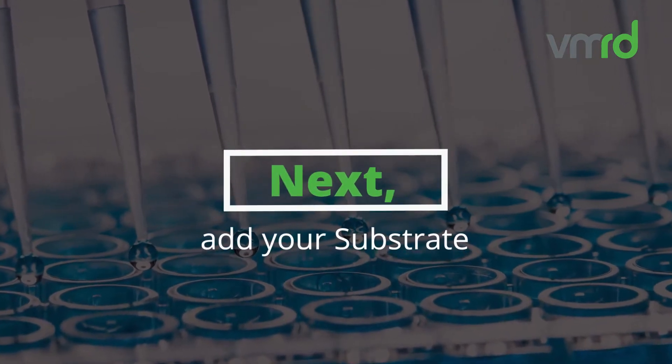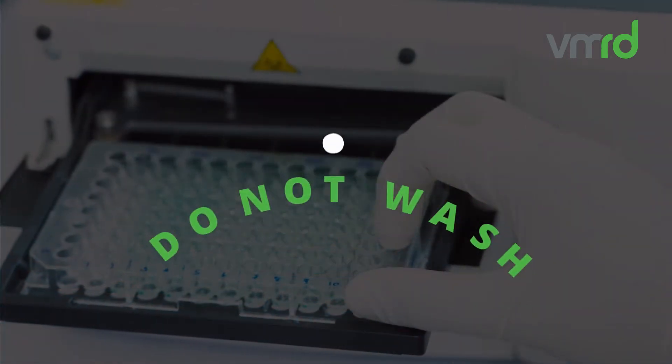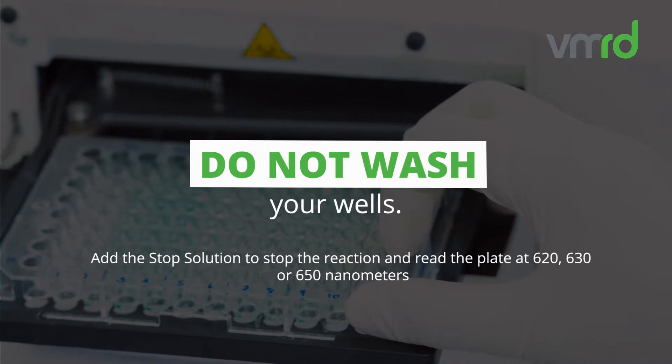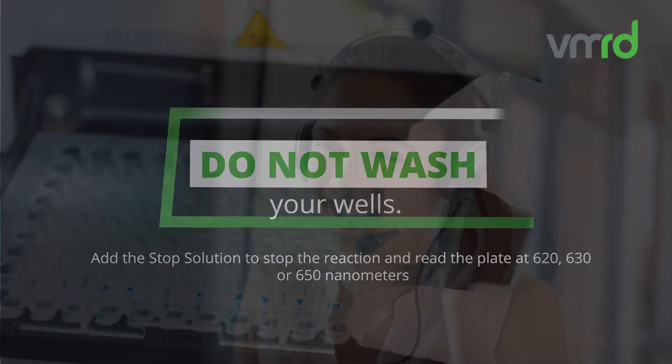Next, add your substrate and incubate for 20 minutes at room temperature. Do not wash your wells. Add the stop solution to stop the reaction, and read the plate at 620, 630, or 650 nanometers.